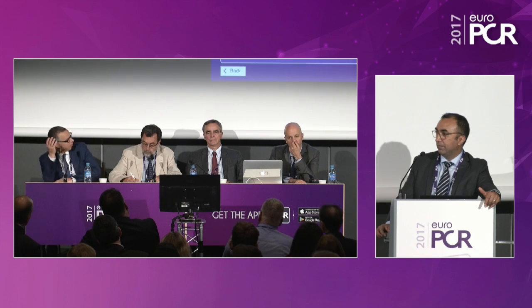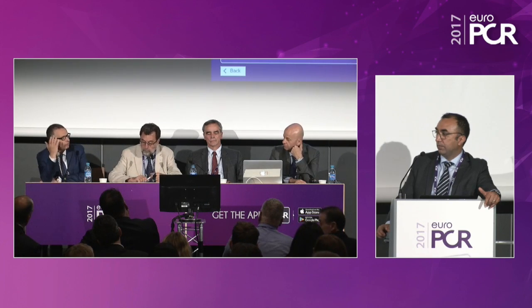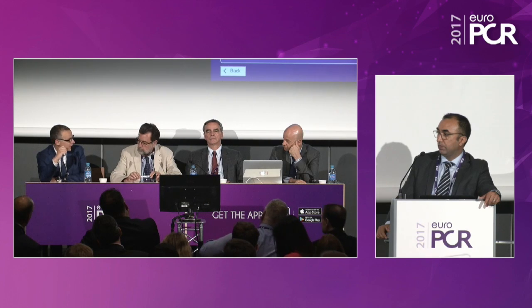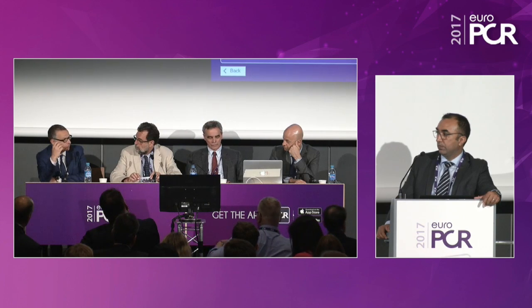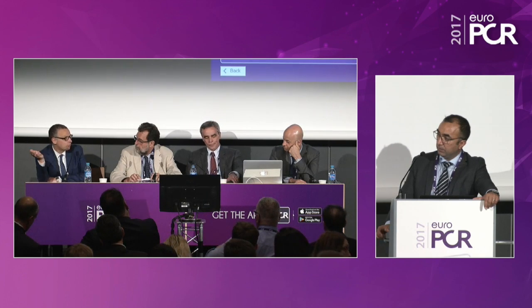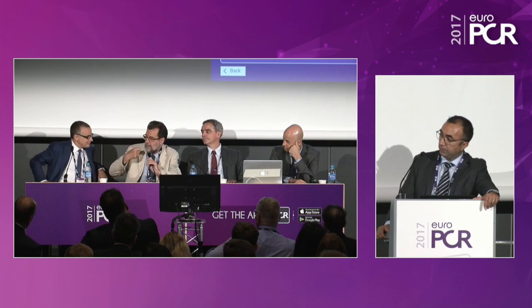As I think about this procedure, the way we design this procedure has not been to palliate. So this is a procedure which has been designed to replace surgery for functional MR and potentially replace surgery also in other fields because this is delivering surgery to a catheter. So the ideal patient in the future will be all patients who require repair.